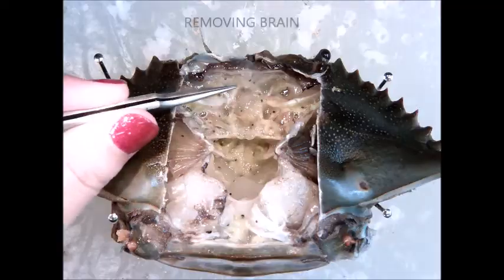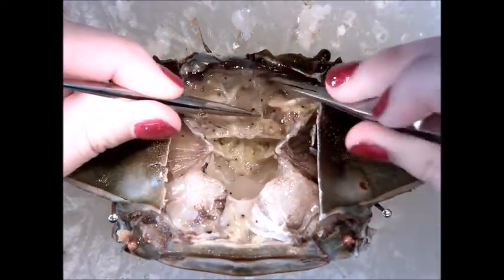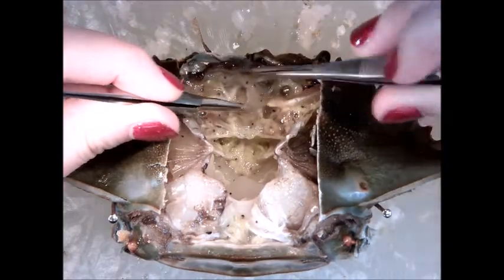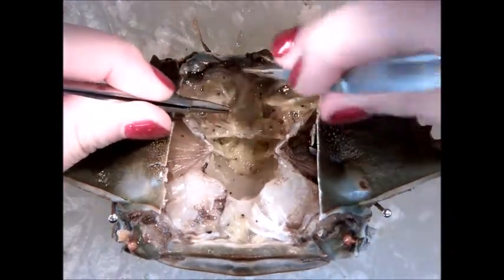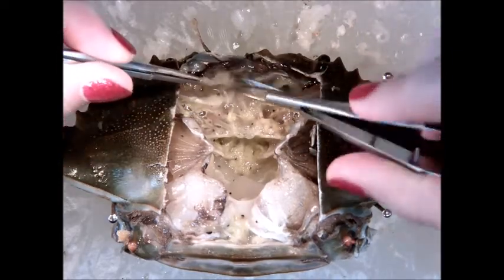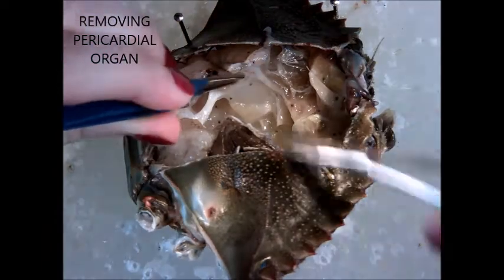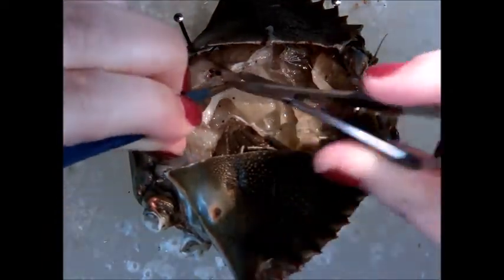for 1 day. The secondary antibody binds to the primary antibody, which allows us to trace GABA throughout the central nervous system under a fluorescence microscope. We are performing these immunohistochemical experiments to try and find the location of cells in the nervous system which may contain GABA that project to the cardiac ganglion.